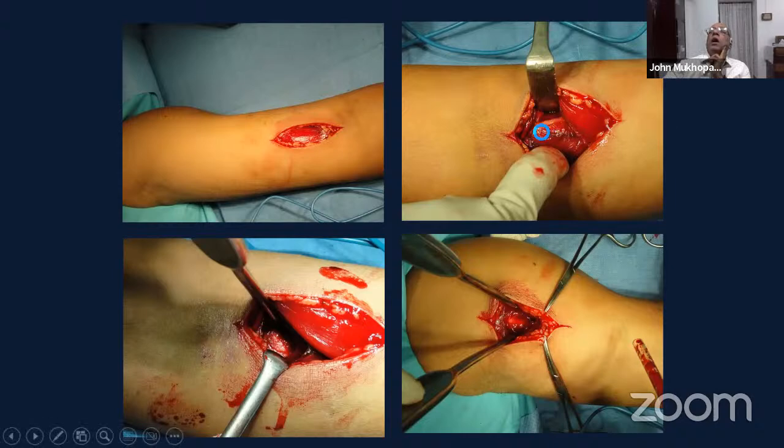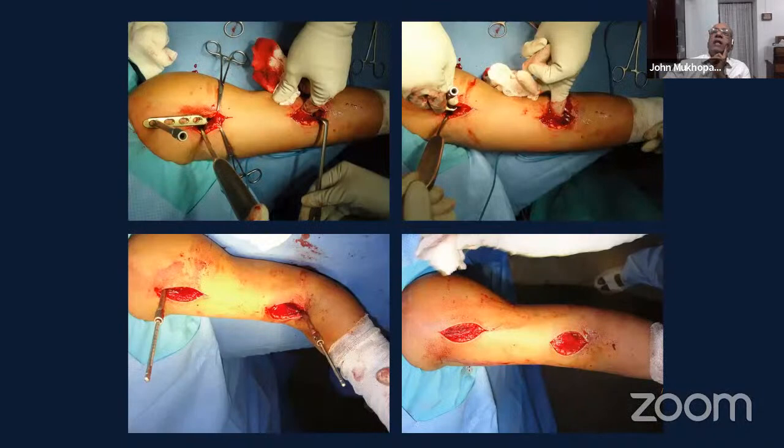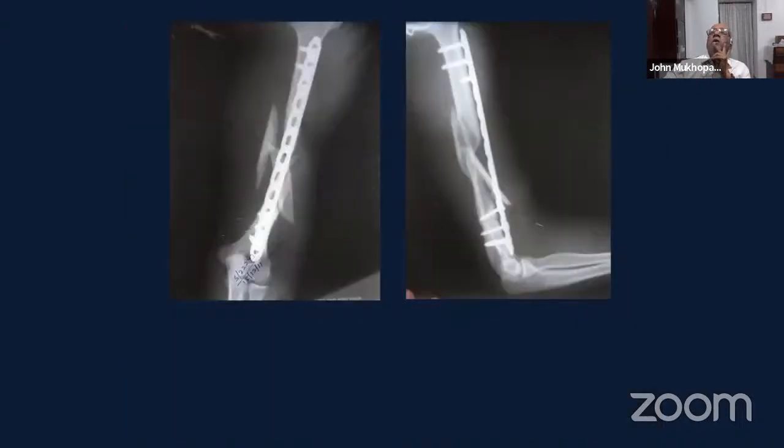So usually you retract the biceps, and then on the brachialis, you can see the musculocutaneous nerve. Your incision is made a little more laterally in the middle of the brachialis, and then you can expose the distal part of the humerus. More proximally, again anteriorly, just beyond the bicipital groove, you can make your incision there. And then you slide your plate, you can do it in either direction, superiorly to inferior or inferior to superior. You do this in an extra periosteal submuscular plane. And once you've got the plane aligned, you can put in your screws to fix the fracture.